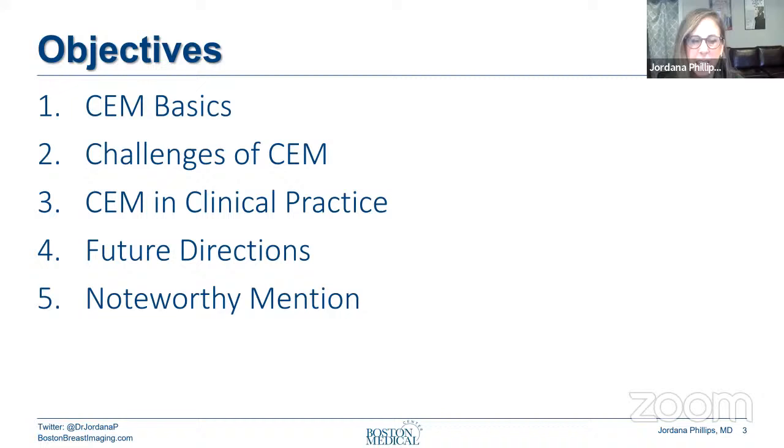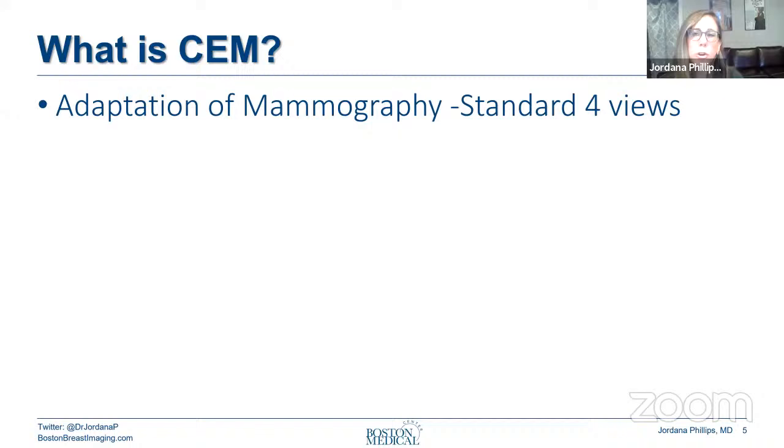So we're going to start by talking about the basics. The wonderful thing about contrast-enhanced mammography, and I should start by saying you'll notice at the top of the slide it says CEM, contrast-enhanced mammography. Some people use the word contrast-enhanced spectral mammography, or CESM, or contrast-enhanced digital mammography, or CEDM. These are all the same thing. So I use CEM, so you'll see that throughout the talk.